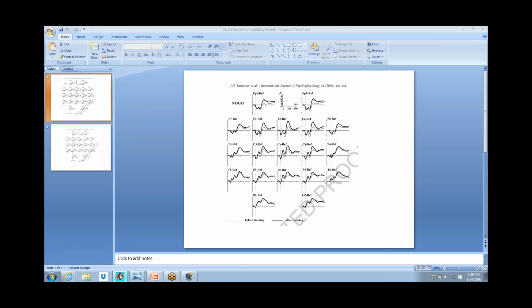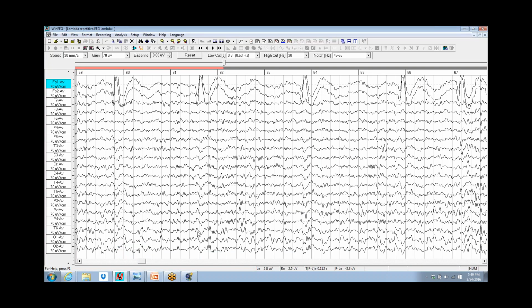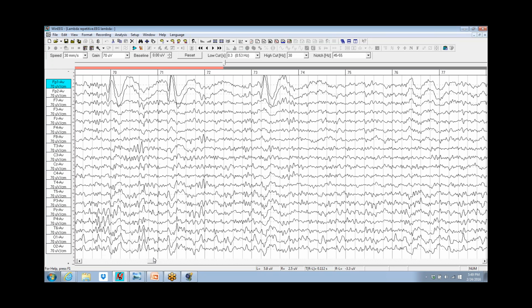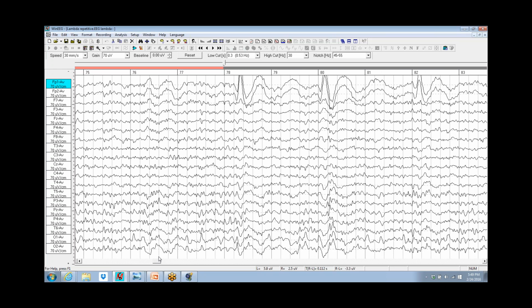Okay, the raw EEG showing 19 channels with the features built into it. The EEG here ends up being a combination of ongoing rhythms and also event-related potentials. You can see here at the back of the head a little occurrence of lambda. You can see the waveform here within the head as a widespread distribution. This is the visual event-related potential, and it's embedded in the raw EEG.